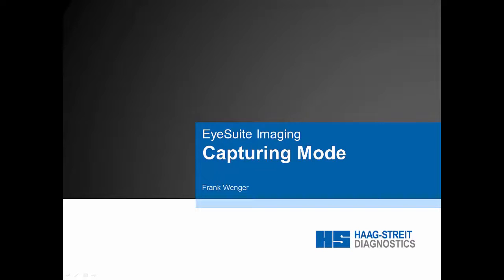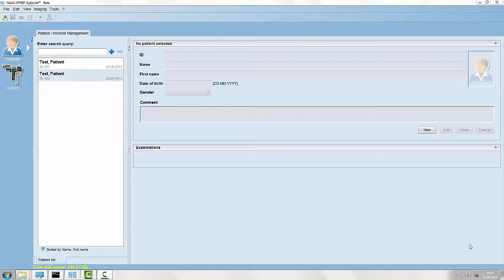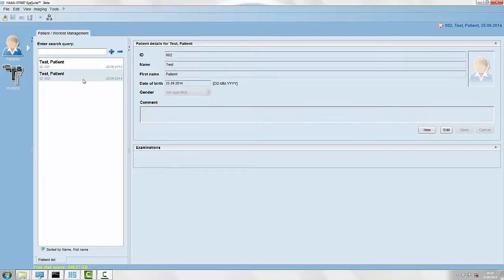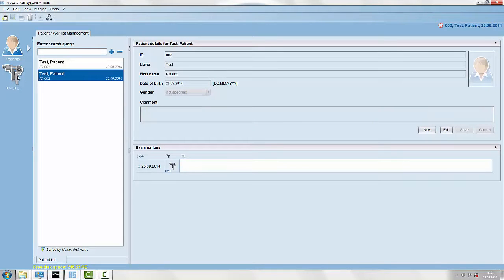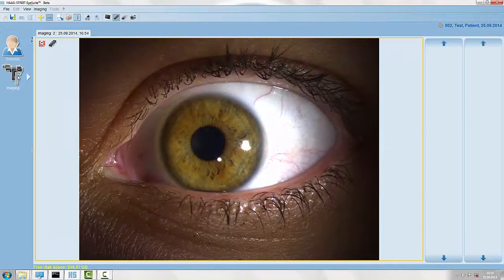This video explains the capturing mode of iSuite imaging. First we open iSuite and select the current patient. Now we click on the slit lamp icon on the left side and enter the capturing mode.